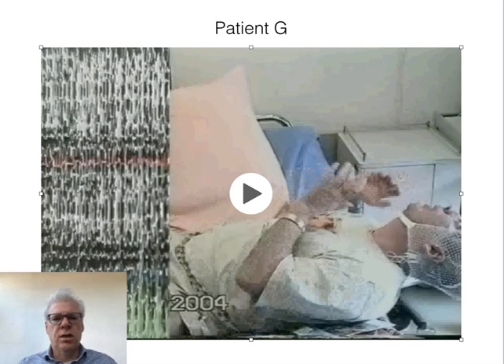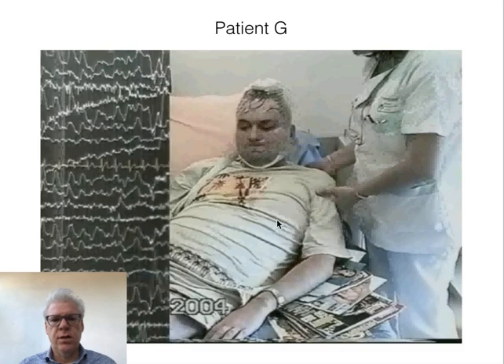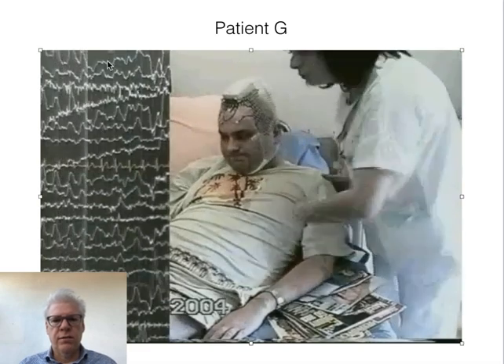And clearly the EEG is hardly interpretable anymore because there are so many muscle artifacts. In this particular patient, this episode was about 2 to 3 minutes, I think. And then, fortunately, most seizures end spontaneously, and this is slightly after the end of the seizure. You can see that the EEG has slowed. It's much more slowing now, which is not completely trivial to explain, by the way. And the patient obviously doesn't feel very well.